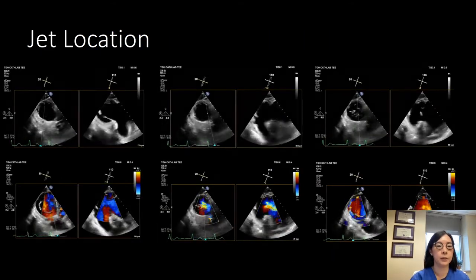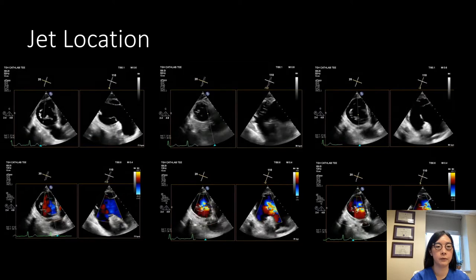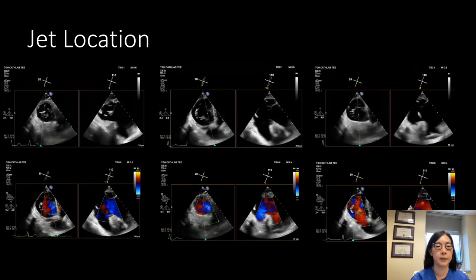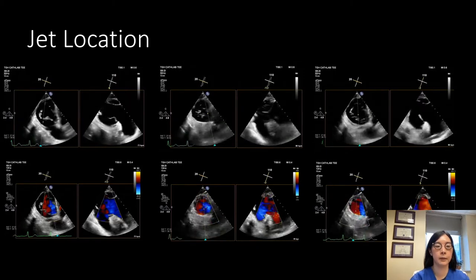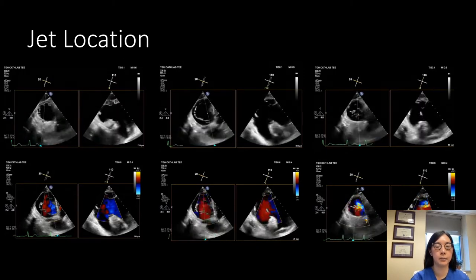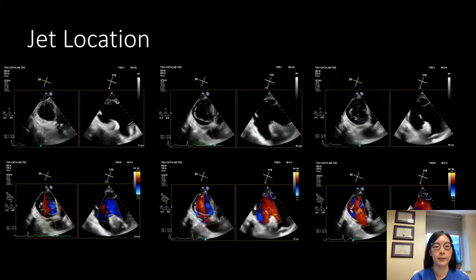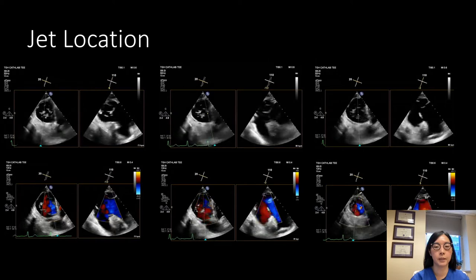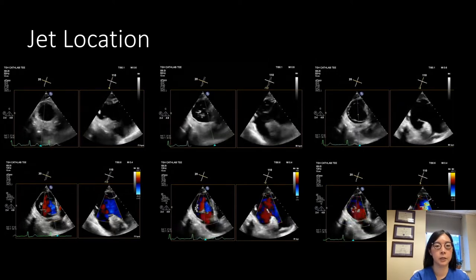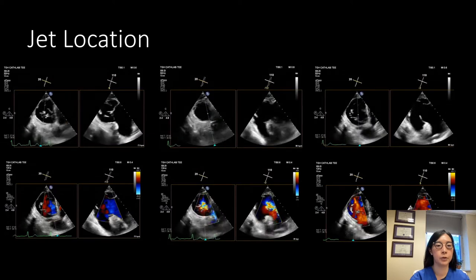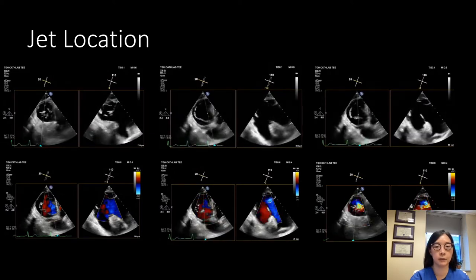We do a series of images in the transgastric views where we cut through the anterior and posterior leaflets, taking images with and without color to see where the jet is originating and what the views look like. In this patient there's a large central jet, but there is also jet coming from between the posterior and septal leaflets as well as the anterior and septal leaflets.